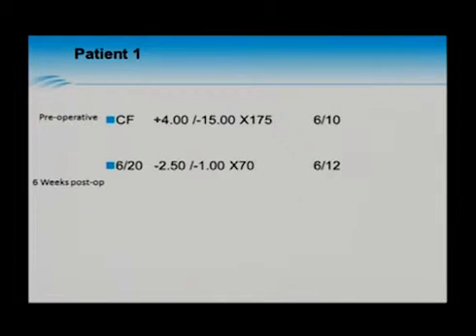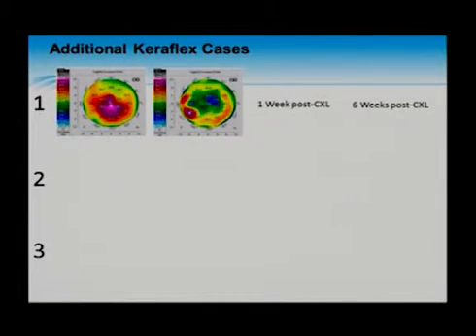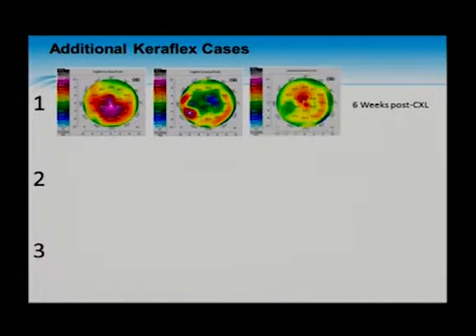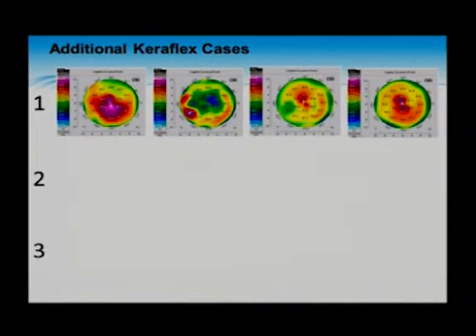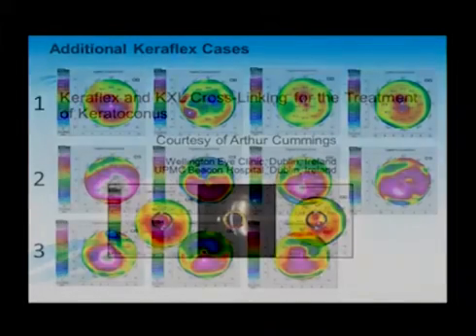Here's the patient 6 weeks out. Look at the change in the refraction and the visual acuity with the cross-linking and Keraflex procedure. Happy patient, needless to say. I'll show you a few other cases. Here's immediately after treatment, 1 week out, 6 weeks out. Dramatic flattening, and more examples. I don't have time to show you those in detail.